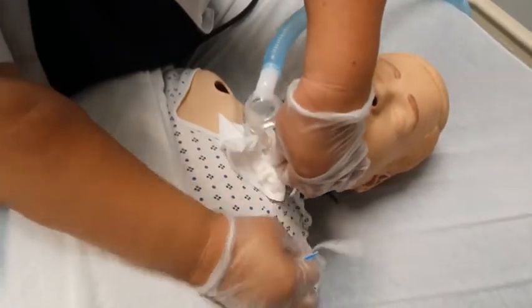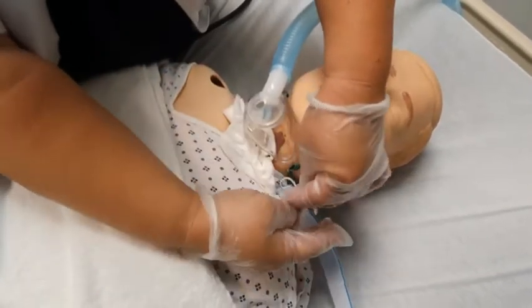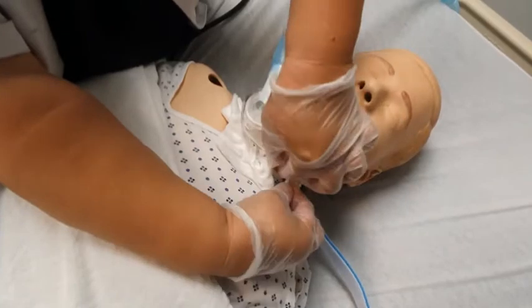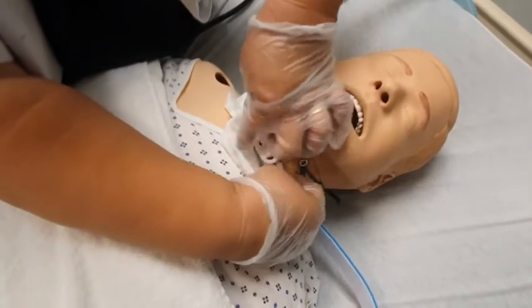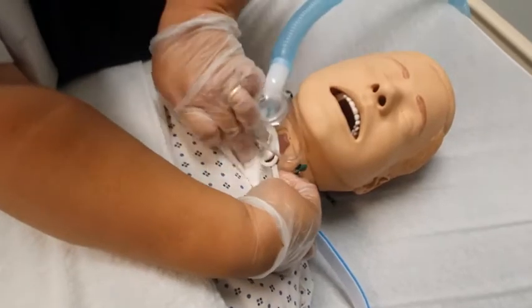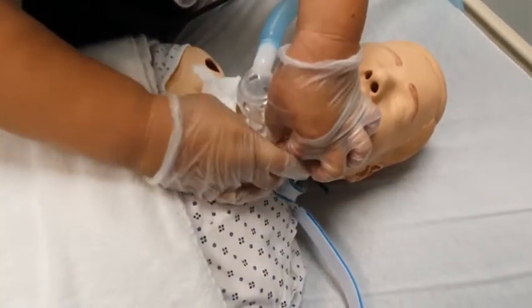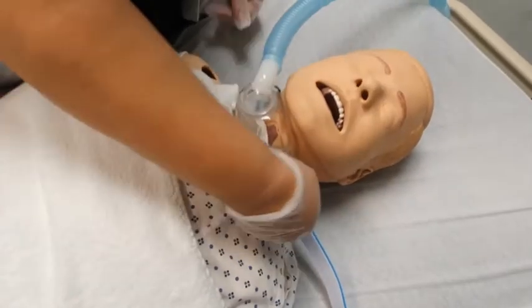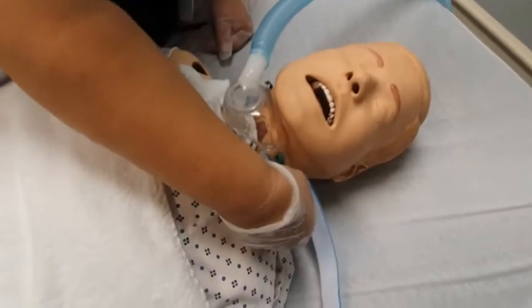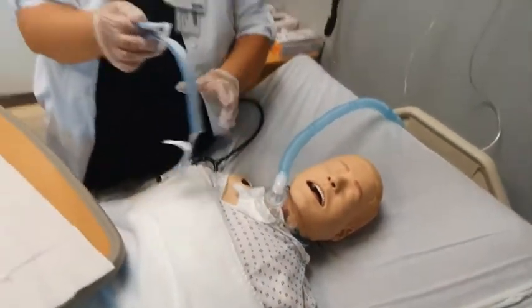And you remove it. You see the flange there is all good and clear. Slide it through. You'll check for the one finger breadth underneath to make sure it's not too tight. You'll take the other trach collar and dispose of it.